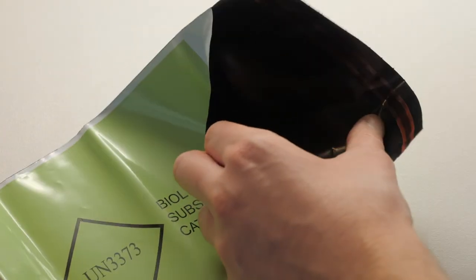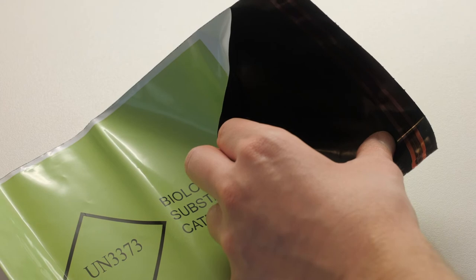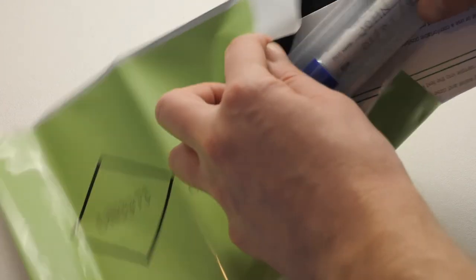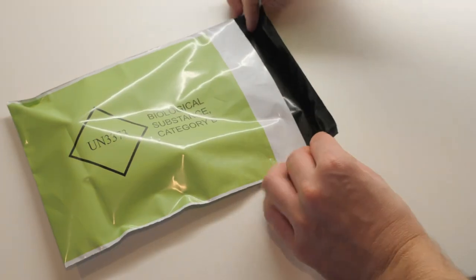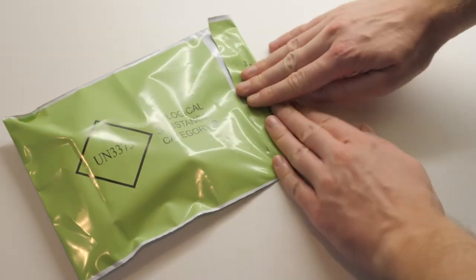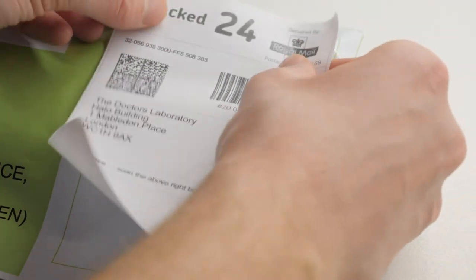Once sample and form are ready, place them both inside the green polyvinyl bag enclosed with each screening tool. Seal the bag and post. Each bag bears a first class postmark and is addressed to the TDL processing laboratory.